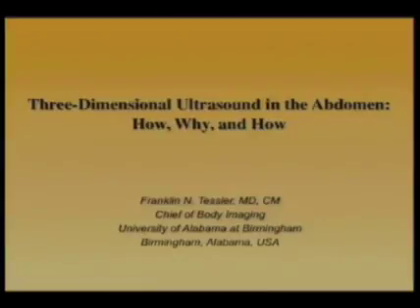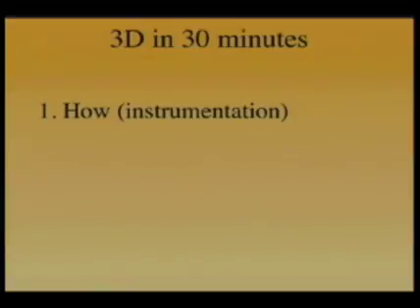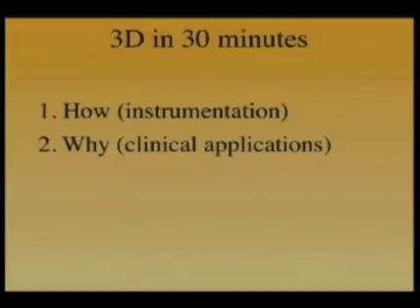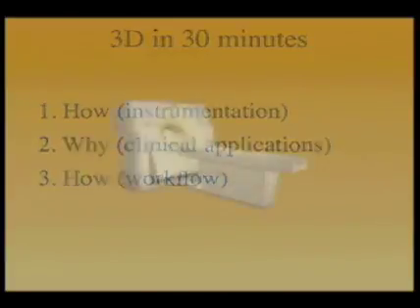I'm going to be talking about three-dimensional ultrasound in the abdomen. In the next 30 minutes, I'm going to be talking to you about three-dimensional ultrasound, beginning a little bit with instrumentation, how it's done, then switching to the why, clinical applications in the abdomen, and concluding with what I feel is perhaps most important in 3D in the abdomen, which is workflow.